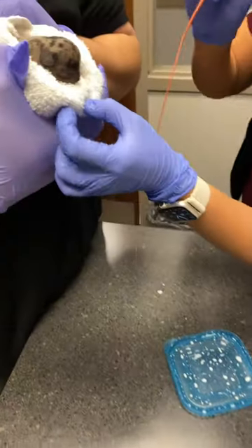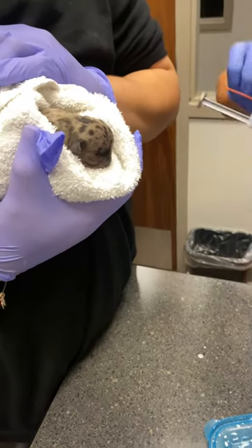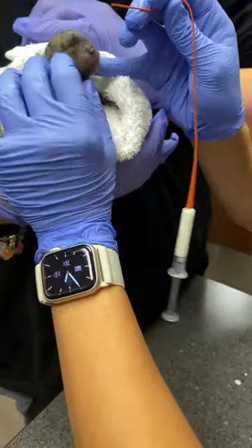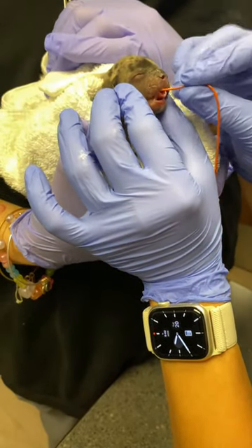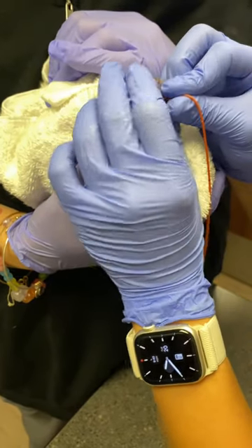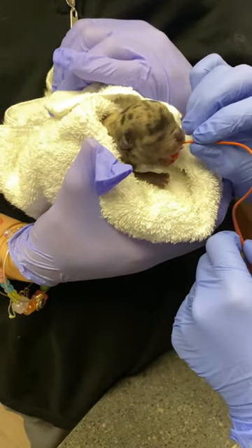Go straight into the mouth, right down the middle, over the tongue. If you look right here — over the tongue, straight down the middle — follow the line of the nose. It's gonna go straight down. You might have to hold it in place as you go down because you don't want it to move.